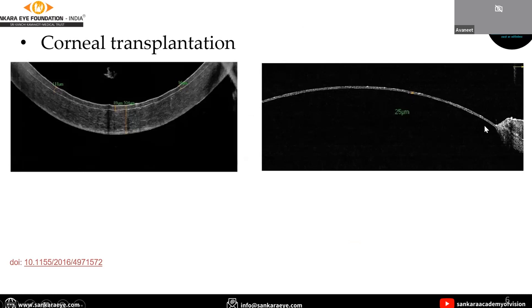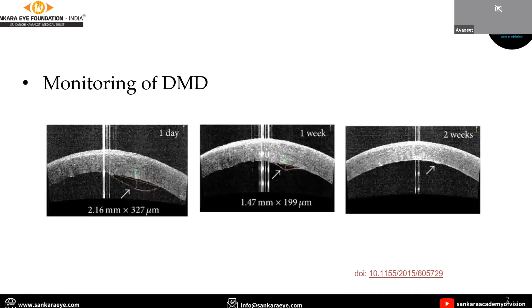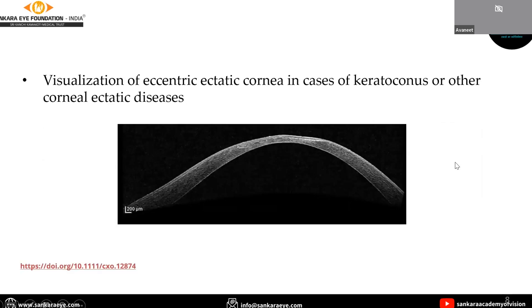This is a case of deep anterior lamellar keratoplasty where dissection is performed until only 25 microns is left. Coming to monitoring of detachment, this is a case of post-cataract surgery where on the first day there was Descemet membrane detachment, which resolved on its own by two weeks. Eccentric ectatic cornea can be visualized in cases of keratoconus, where the contour is changed and there is thinning of the cornea.